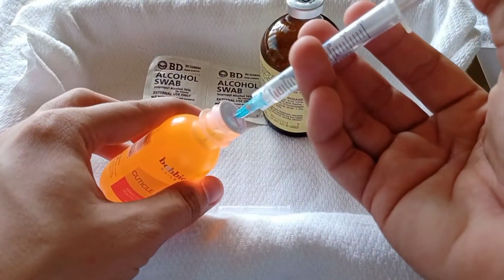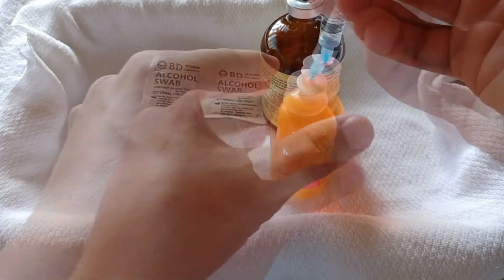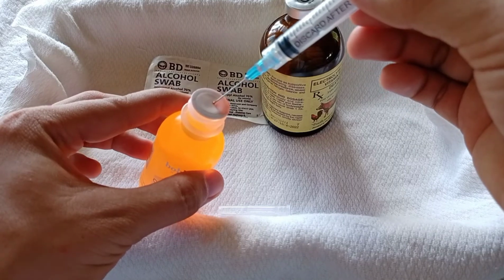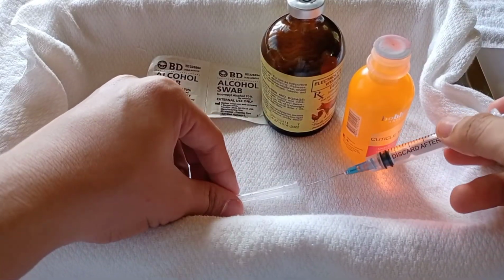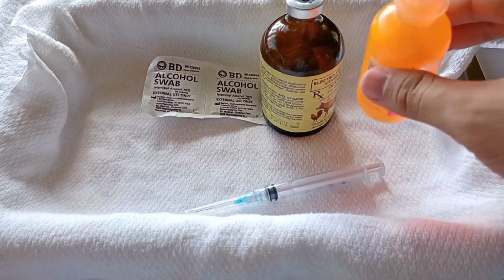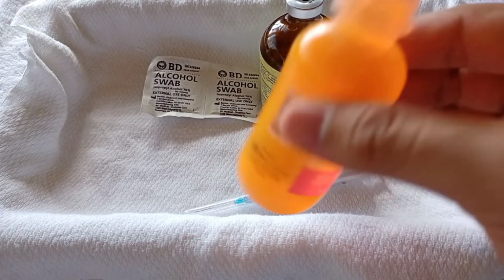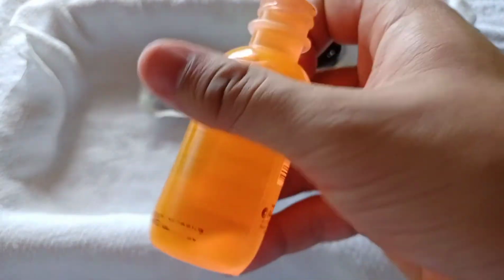Move the plunger down while holding. Then slowly remove the needle. Then do the scooping technique. Shake the vial well. Check if it is diluted well.